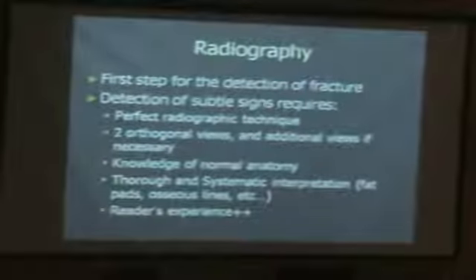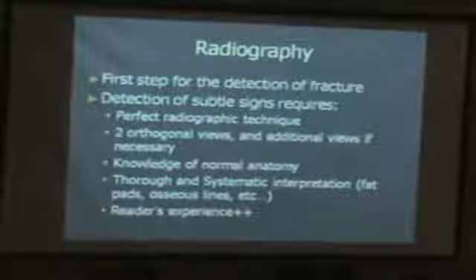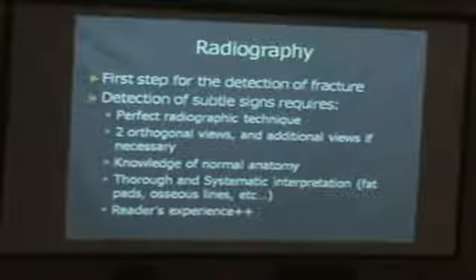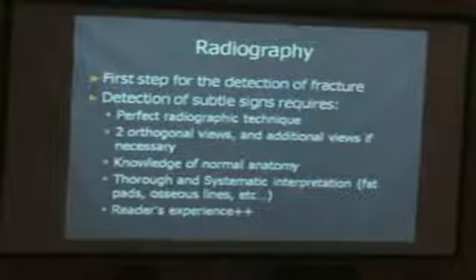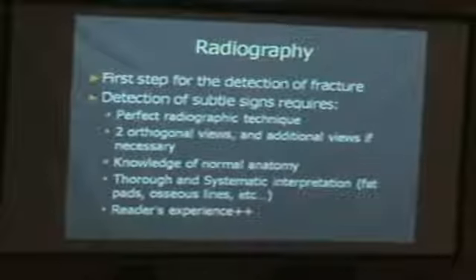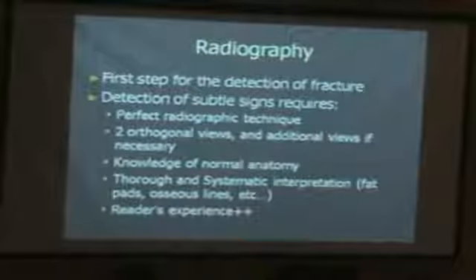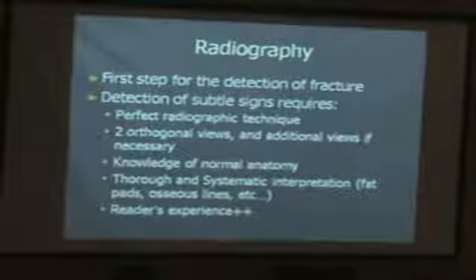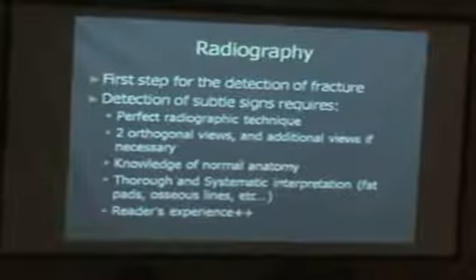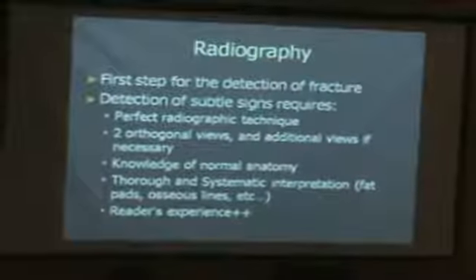Radiography is the first step. I mean, everybody knows about that. I don't want to introduce that, but I want to say that the technique is really very important. And again, as I said all the time, we do very good imaging on CT in my hospital. We do very good imaging on MRI. We do a very bad job on X-ray.